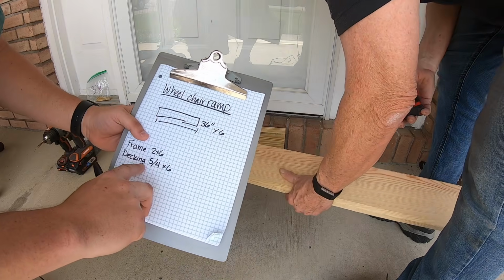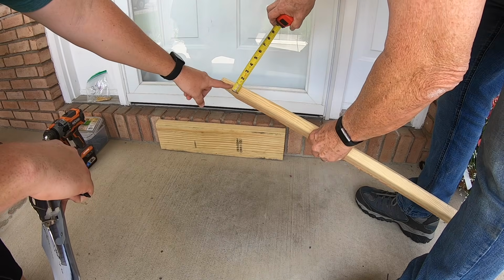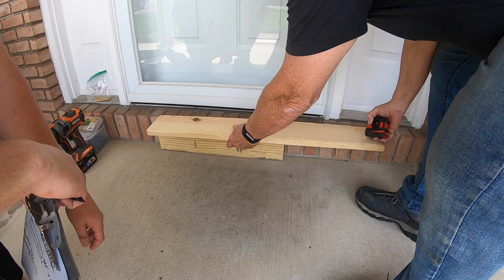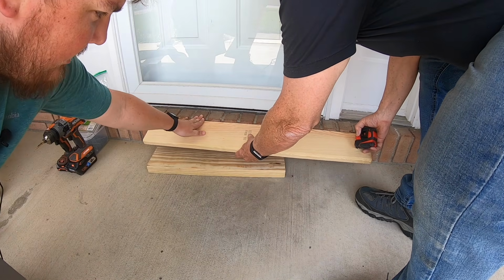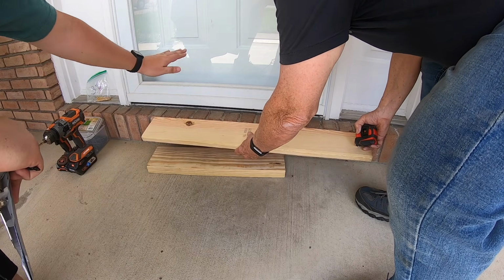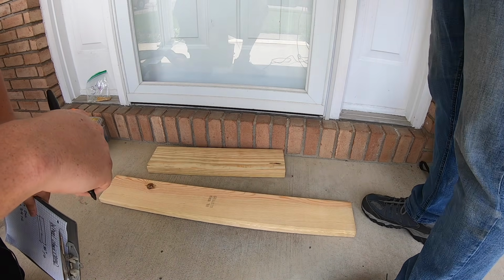We do have to keep that in mind as well, because the frame is going to be a 2x6. The decking will be 5/4 by 6 inches, and that's your decking right there, which is really about 1 inch. Almost all wood is not the right length and width. That's just what they call it, and so we will have to trim down a little bit so it is nice and flush here. You'd rather have just a little bit less than too high and have a big bump there, so it can transition down and slowly slope down so that the wheelchair can go easily up on it.